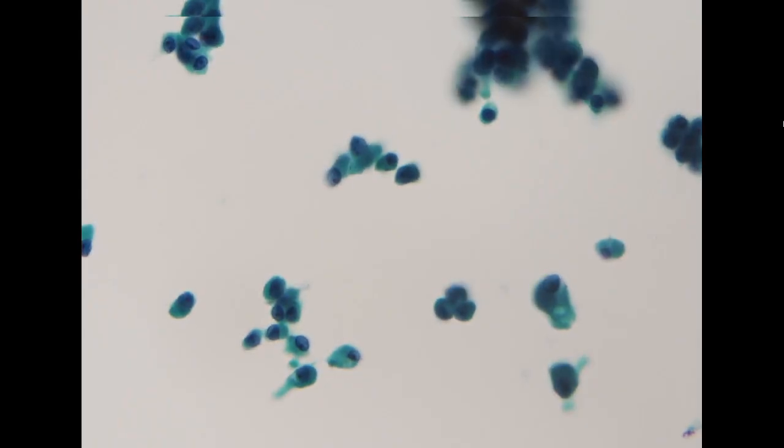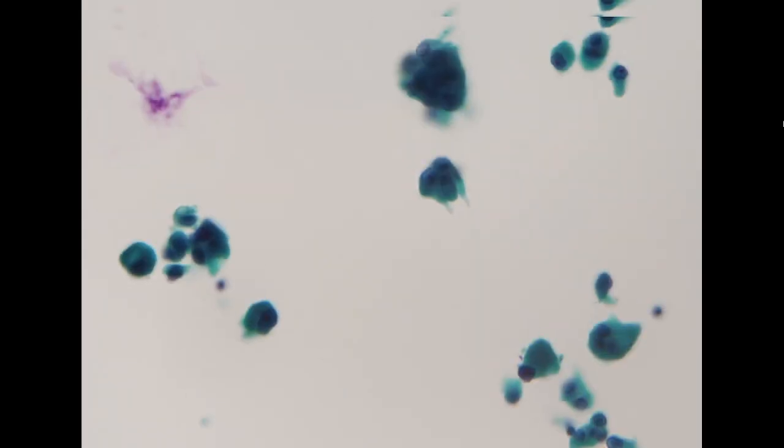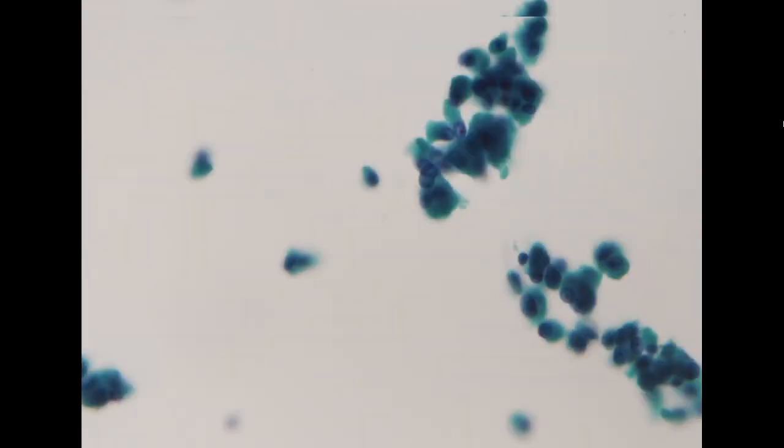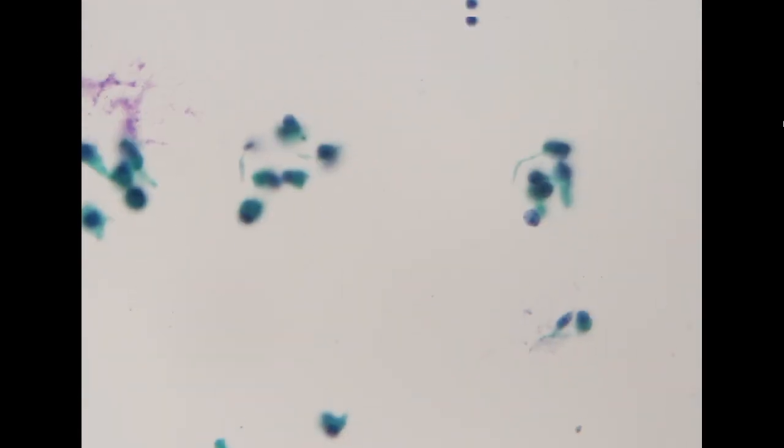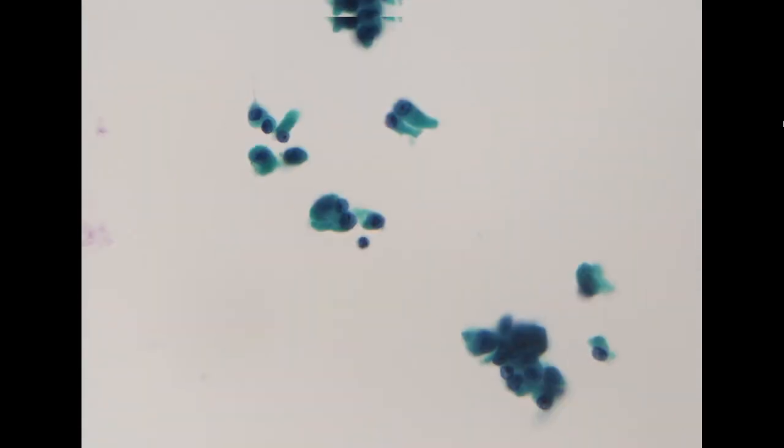But because of this very dense cytoplasm, as well as prominent nucleoli and lack of neuroendocrine chromatin pattern, we also need to think about an oncocytic follicular tumor.